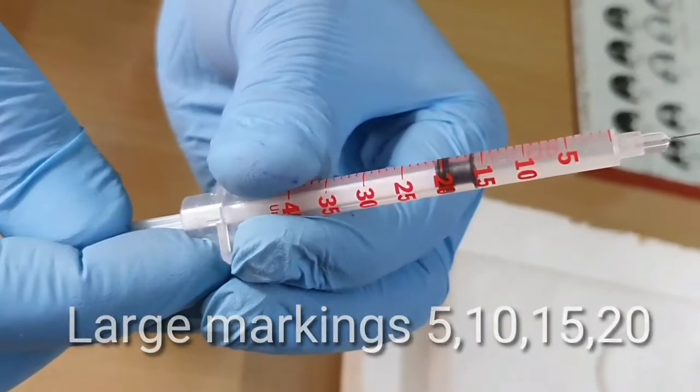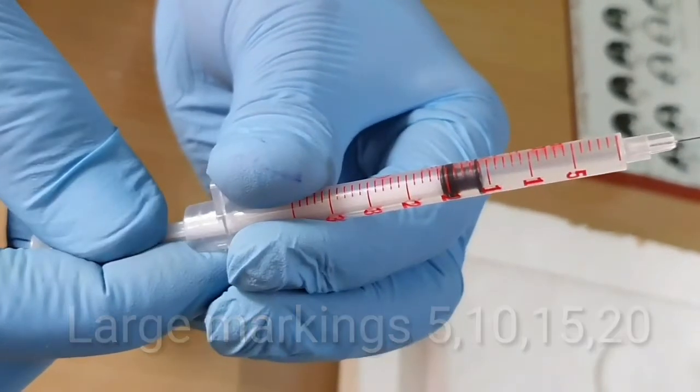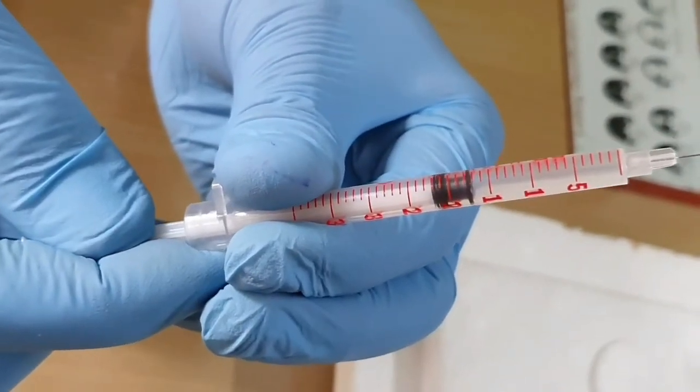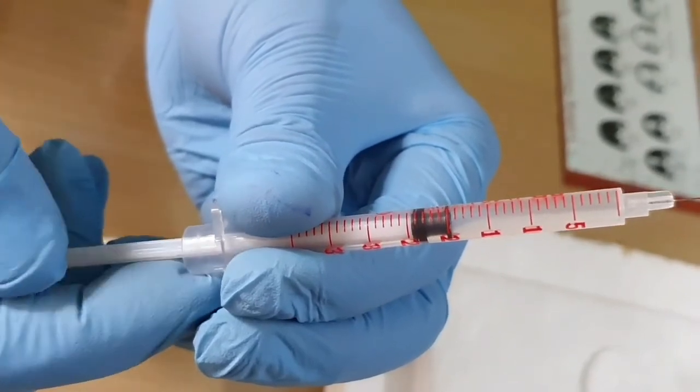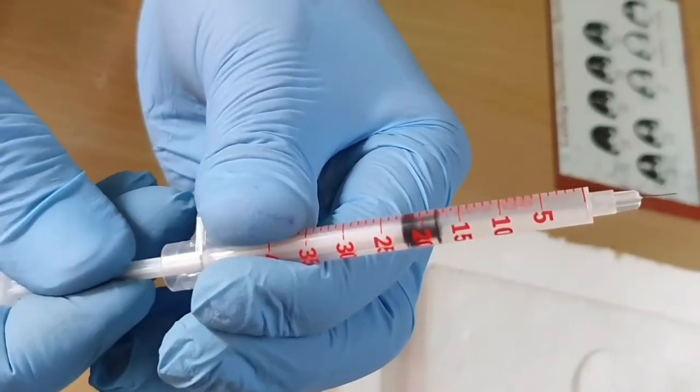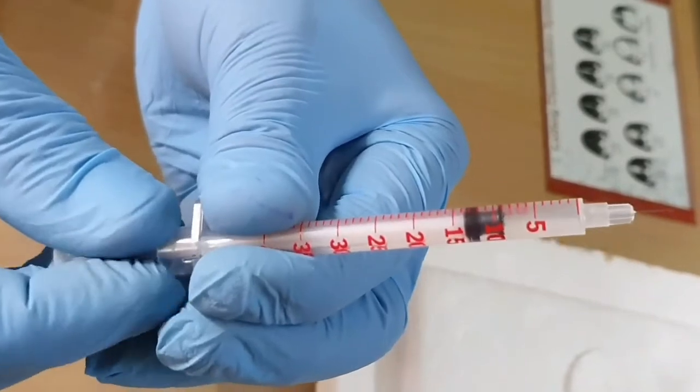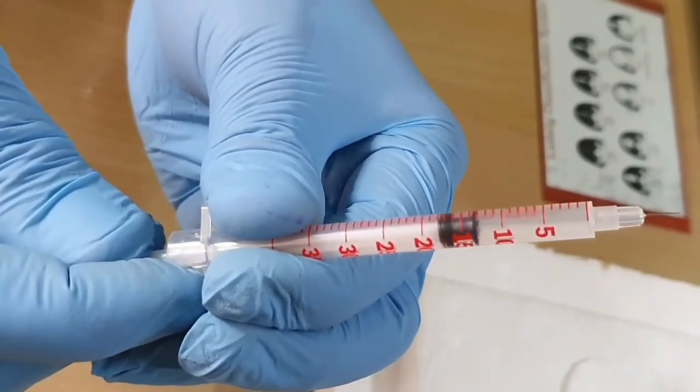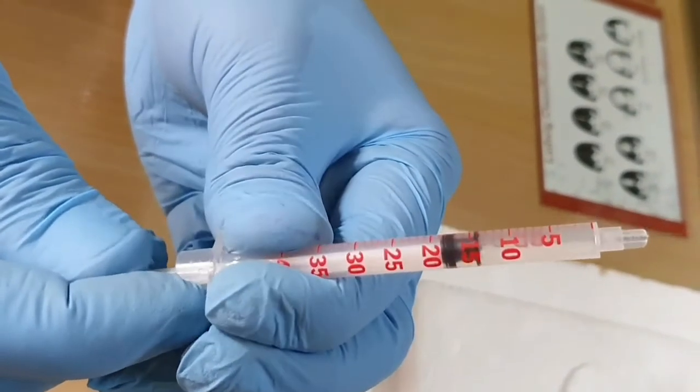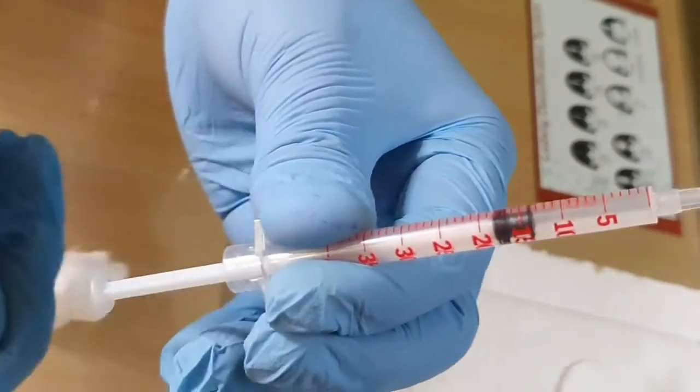Now we have the 16 mark, 17 mark, 18, 20 like that. Suppose we are going to inject 14 units, we have to withdraw air first initially. See, I have kept it at the 14 mark: 10 plus 4 smaller markings.